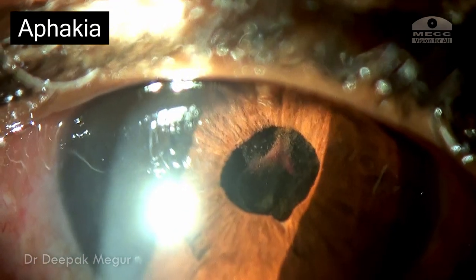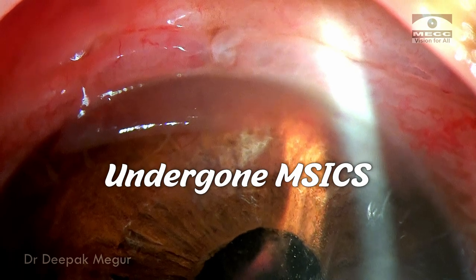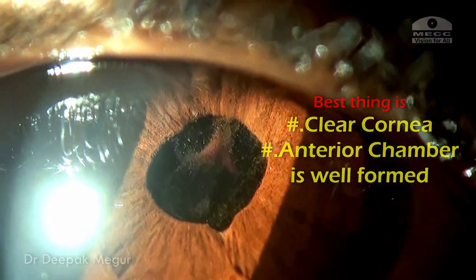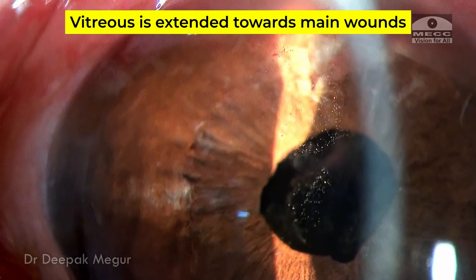On examination, we can see that the eye is aphakic. It looks like she has undergone a manual small incision cataract surgery with a scleral tunnel incision. There is vitreous in the anterior chamber which is mixed with pigments and blood and it is running all the way towards the wound.